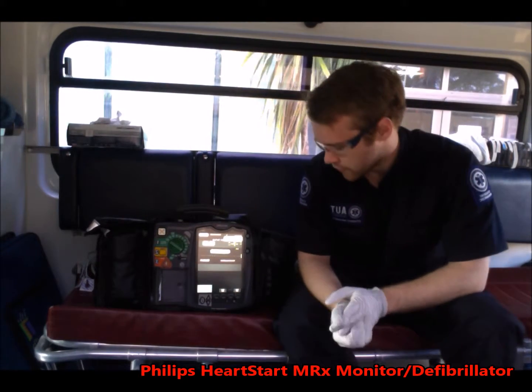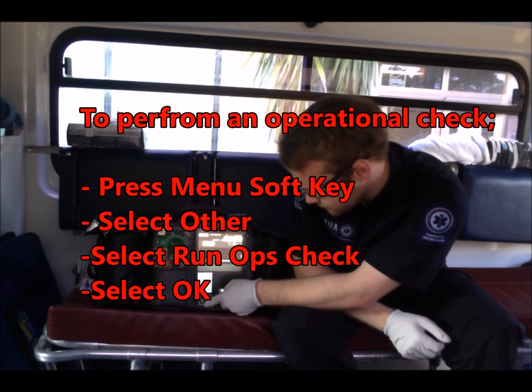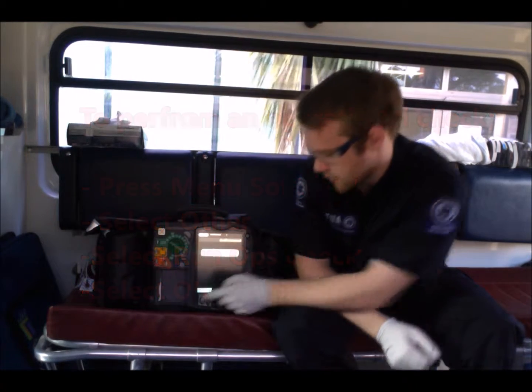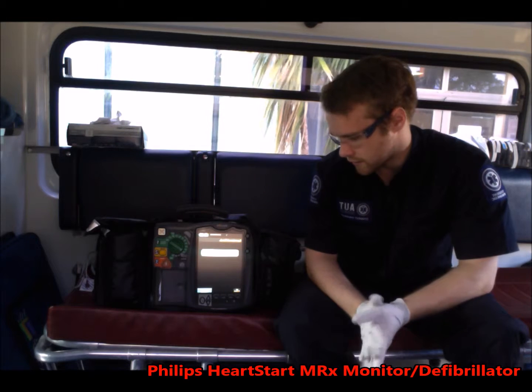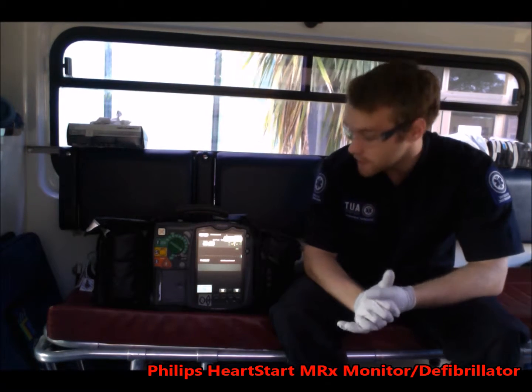And next we want to do an operational check. And run op check, so we just do that. That's it there, doing an operational check on itself. Once the operational check is complete, we can now do a defibrillation test.